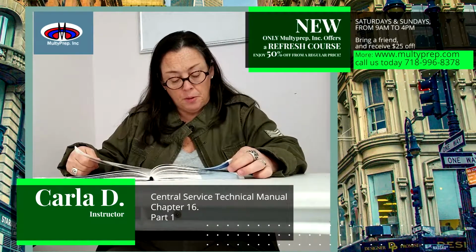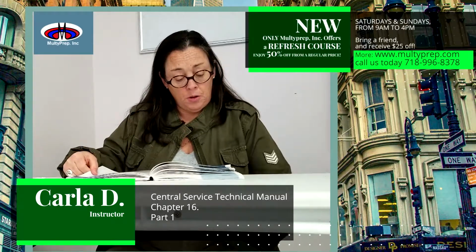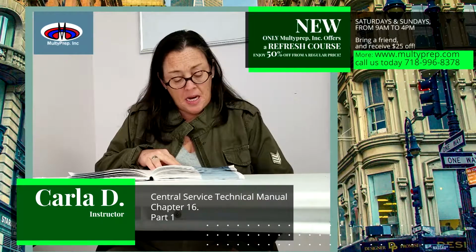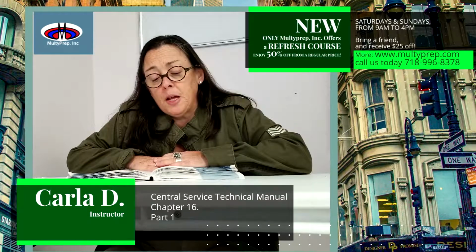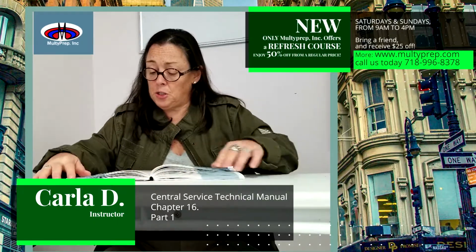Regardless of the system in use, there are a few standards that must be followed. First, the bottom shelf of each unit must be between 8 and 10 inches from the floor. This protects stored items from contamination due to floor cleaning agents and dust. The bottom shelf must be solid to protect items from environmental cleaning. If the shelf itself is not solid, commercially purchased shelf liners may be purchased to line the bottom of that shelf. See figure 16.8.